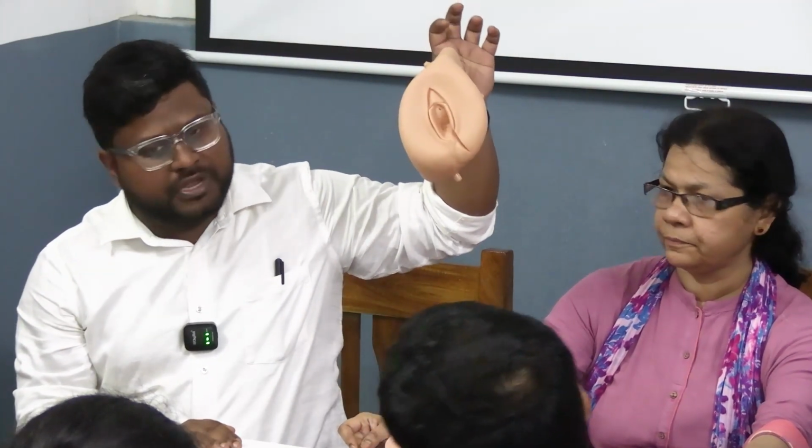We have to start the repair. Wait, your patient is bleeding currently. Don't waste any more time. See again, this is an episiotomy tear. As we said, most commonly it's a second degree perineal tear.